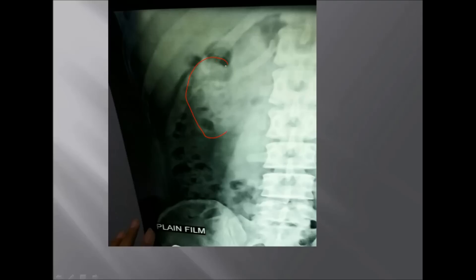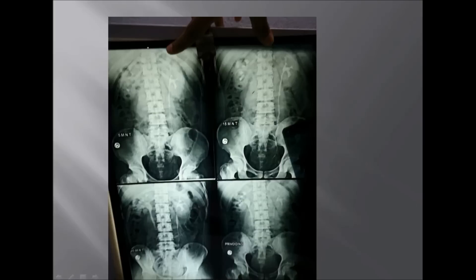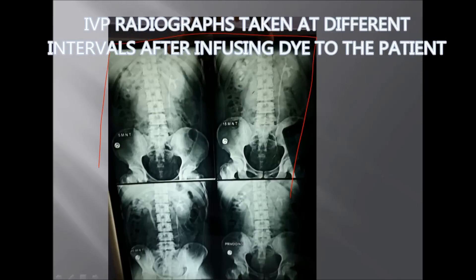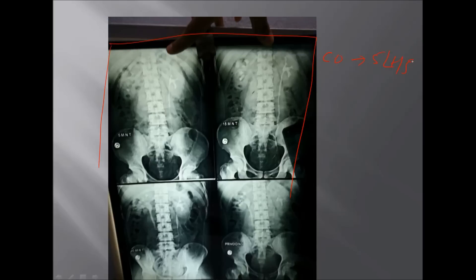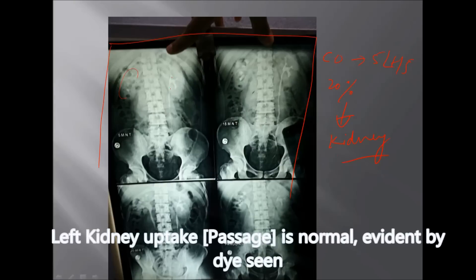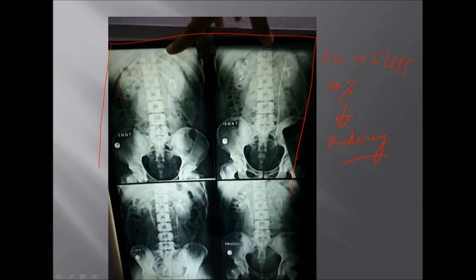Now if we look closely we can see hydronephrotic changes in the kidney. This is a proper IVP just done. As we know, cardiac output is 5 liters per minute and 20 percent is diverted to the kidney. When we infuse the dye — you can see it here — it is radiopaque, that's why we are able to track the kidneys and ureters. We can see the left side accumulating dye at the perfect rate, showing normal flow, but on the right we are unable to see the dye, so we can conclude there is some obstruction in the right kidney.